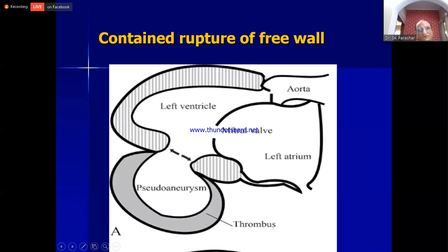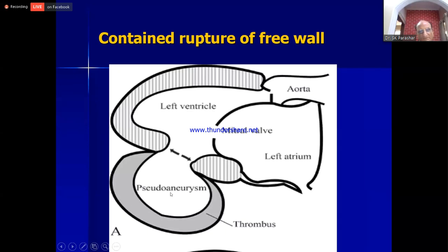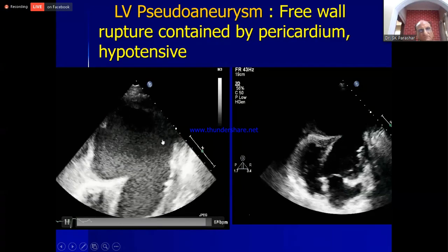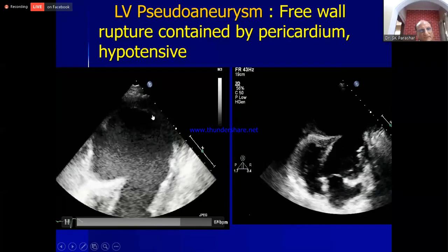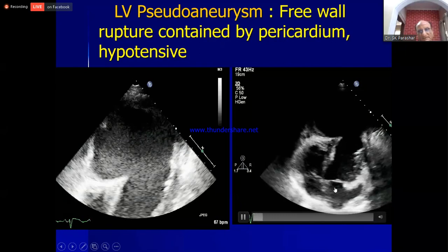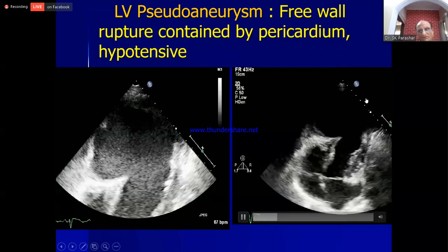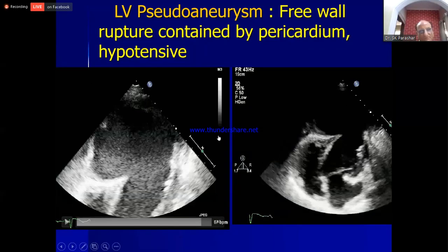A pseudo-aneurysm is a contained rupture of the free wall contained by the pericardium, not by the myocardium. In a pseudo-aneurysm on echo, there is a narrow entry point (the neck) that is small compared to the whole aneurysm, and no myocardial tissue is seen at the wall. This is an emergency situation requiring immediate surgery.